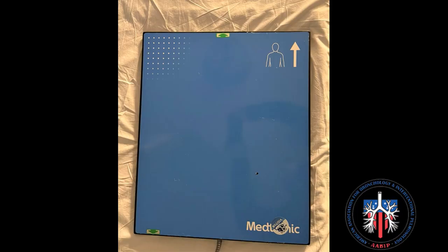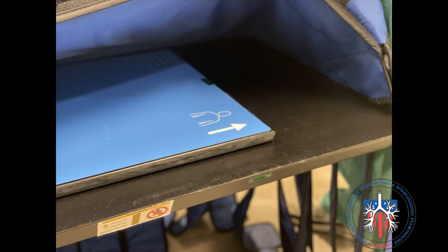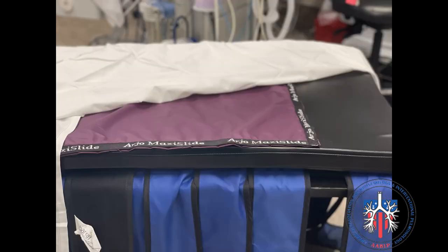Location board: the location board is necessary to help generate an electromagnetic field. The board is positioned underneath the patient and oriented with the cord towards the feet and the yellow dot towards the head. The board is positioned underneath the mattress and oriented as shown. The patient's torso is directly above the location board.